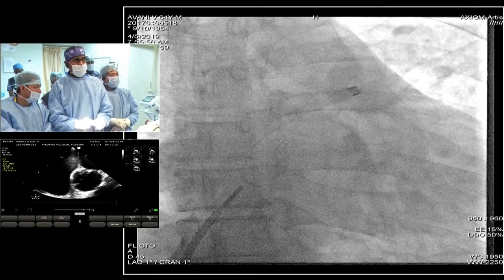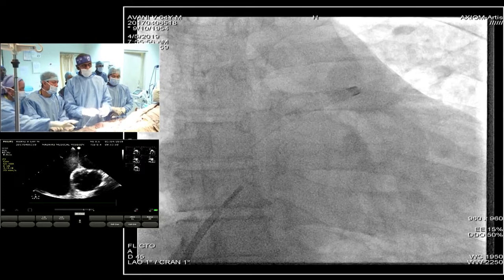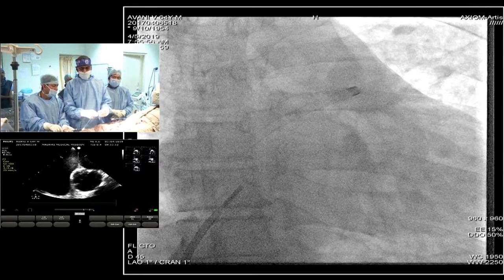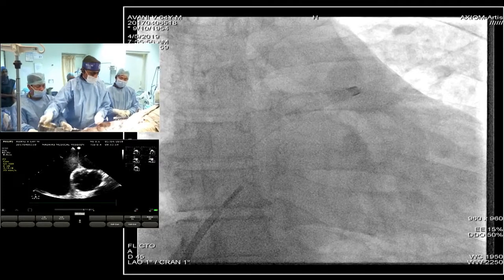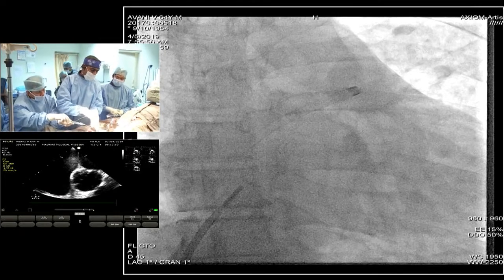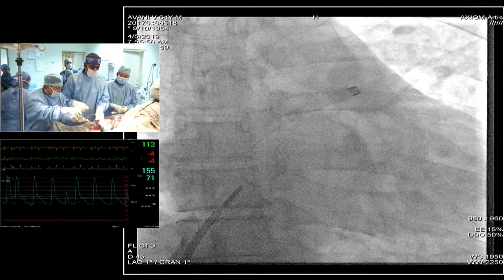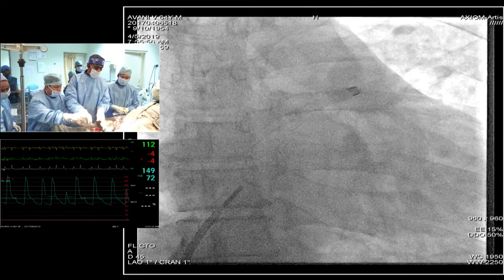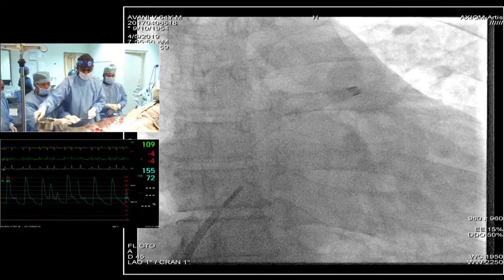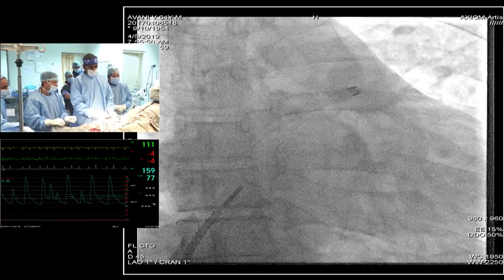But in a patient who is around 50 or 60 years, this gentleman is 64 years, who has not so beautiful transthoracic windows, we would like to use intracardiac echo. Intracardiac echo, in view of the expense of the probe, is not our preferred option in all the cases. We do it very sparingly. The probe is prohibitively expensive.